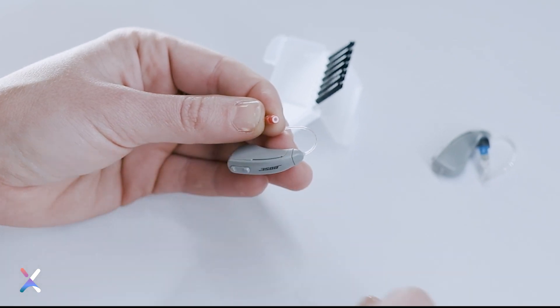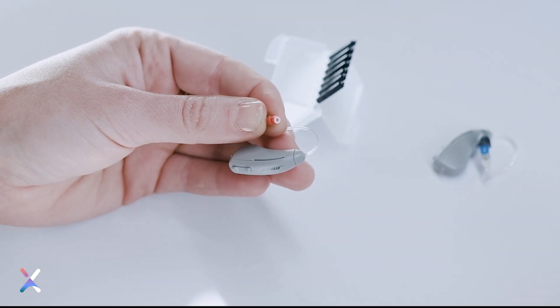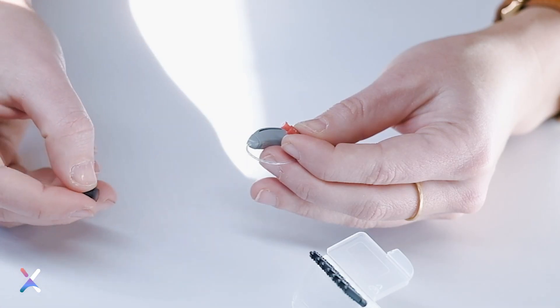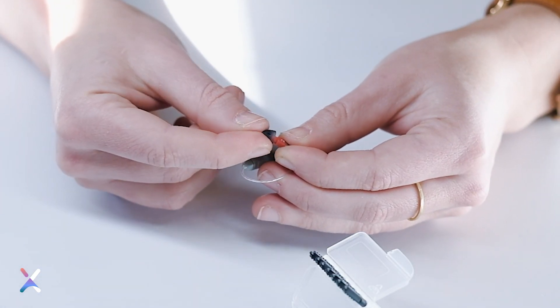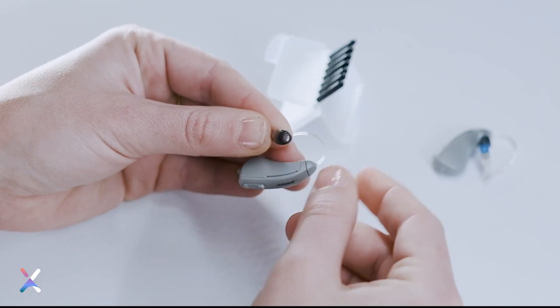This ensures the wax guard is secure and helps prevent it from falling off in your ear canal. Once the wax guard is correctly inserted into the hearing aid, reattach the dome.